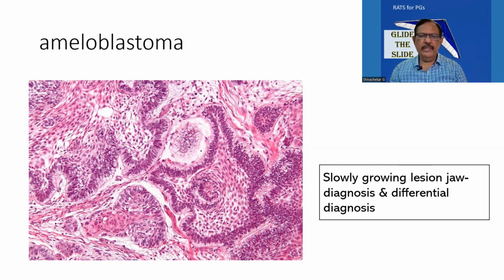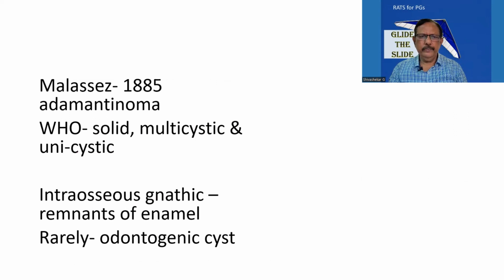The diagnosis is ameloblastoma. Given the history and the picture, it is classical. Malassez in 1885 gave the term adamantinoma. Later on, this has been replaced by ameloblastoma.